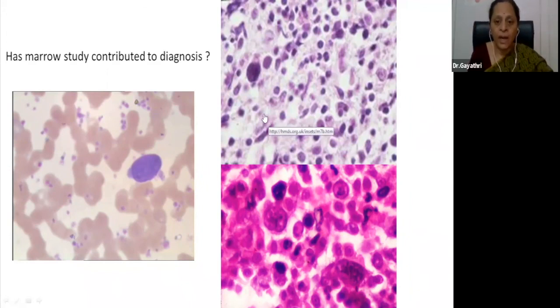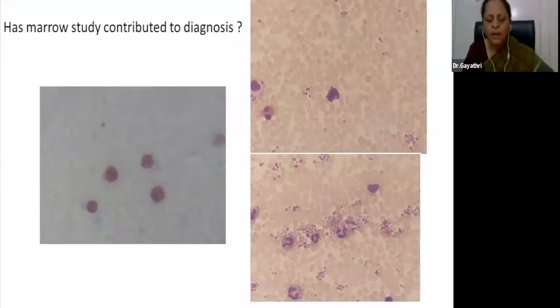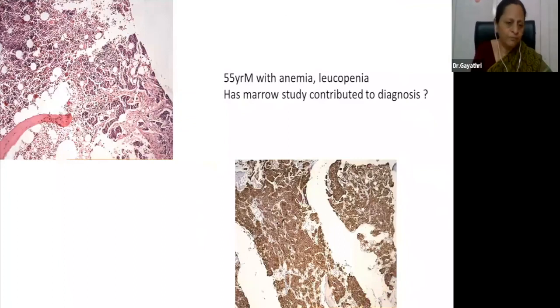and abnormal platelets in the background. The aspirate was negative, a dry tap, and you see a classical textbook case here of megakaryoblastic leukemia. This is from another case of ours in which you see cells which almost look like metastatic carcinoma cells. These are megakaryoblasts. Okay? So the rare entity of M7 requires not only peripheral smear but also marrow evaluation for establishing the diagnosis.